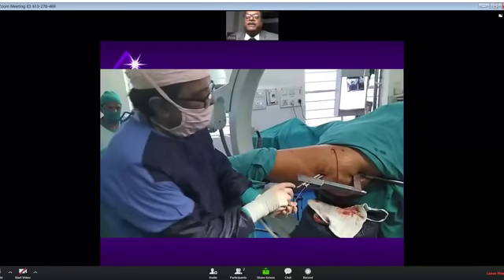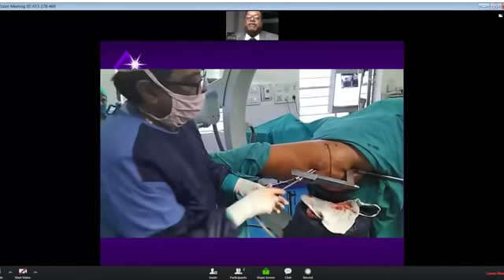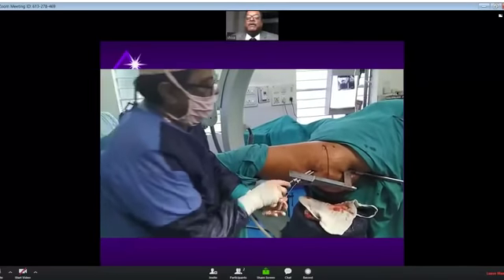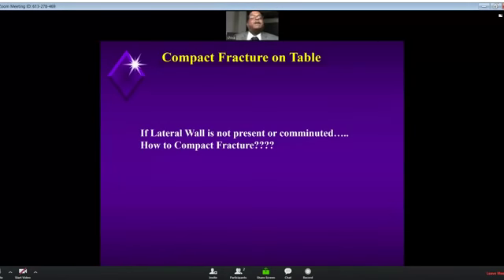I have been judiciously doing this for the last years, probably since 2008 or 2009, and my complication rates have reduced drastically because of this. Compressing the fracture gets the head of the screw touching the lateral cortex, and rocking of the screw within the nail is prevented to a great extent, and that also prevents the screw from backing out or the Z effect from happening. So, this is the reason why I say that you should compress the fracture beautifully in all these cases.